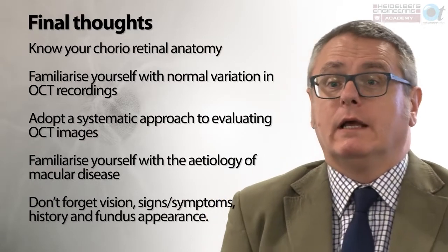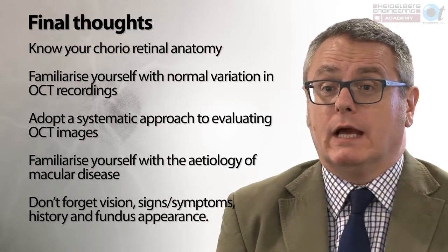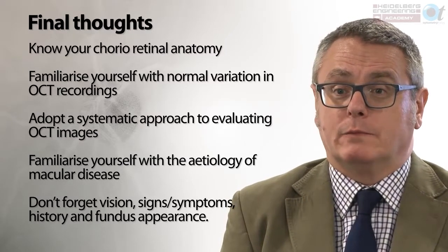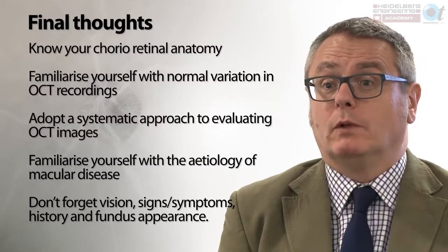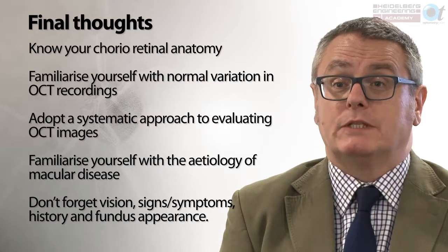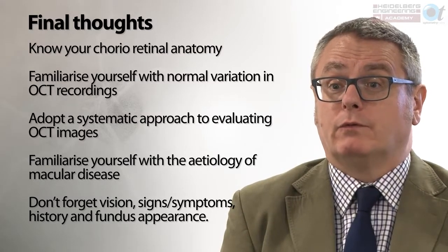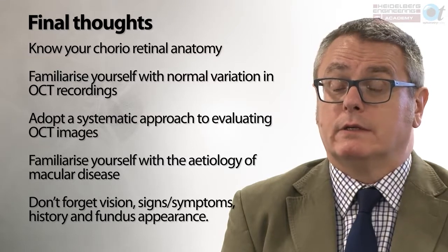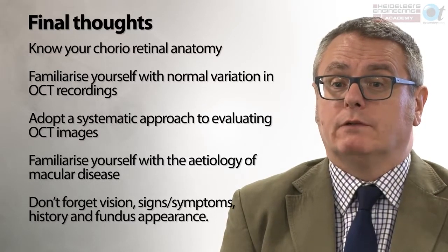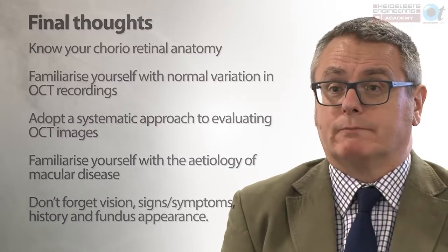Final thoughts then. Know your chorioretinal anatomy. It's important to revisit all the information that you studied during your undergraduate programs. Familiarise yourself with normal OCT structure and variation within the recordings. Adopt a systematic approach to evaluating your OCT images and familiarise yourself with the etiology of macular disease. And don't forget the basics: vision, signs and symptoms, history and fundus examination are core skills when evaluating your patients.